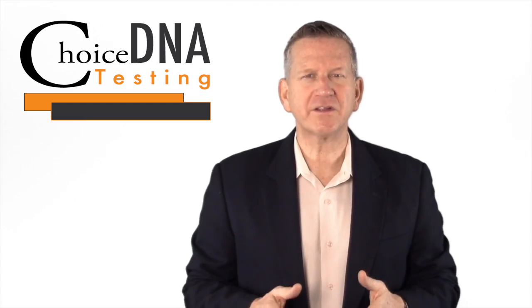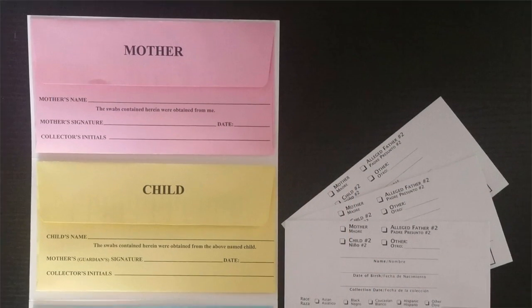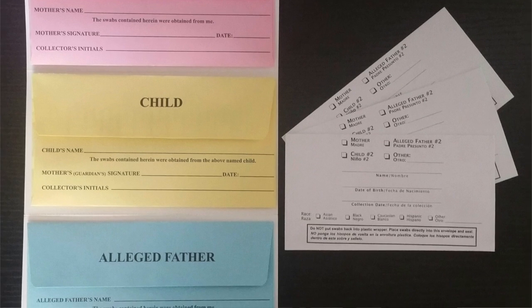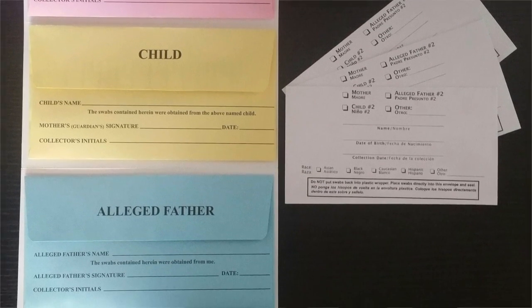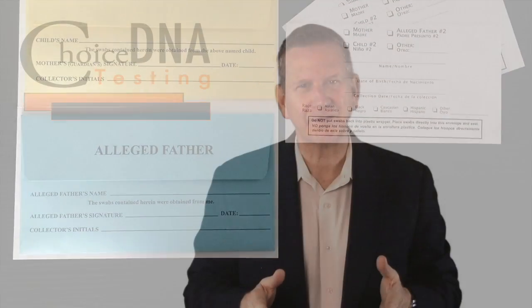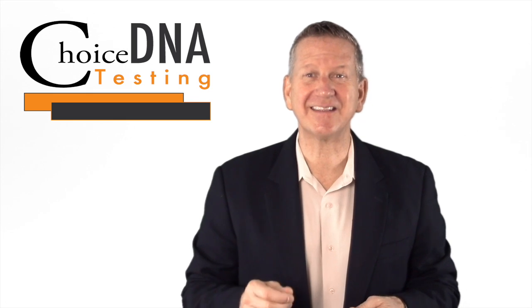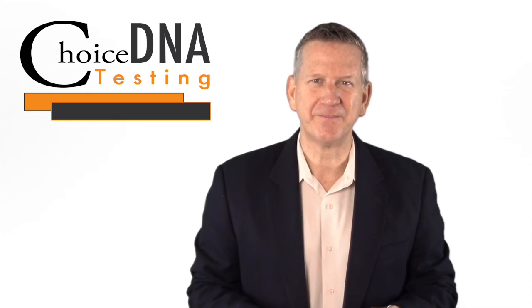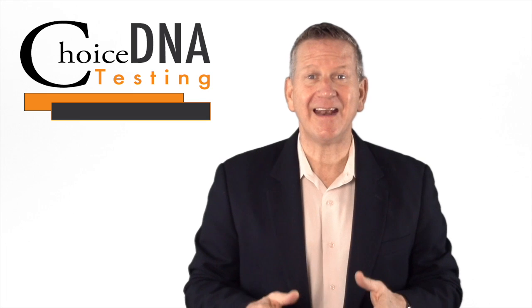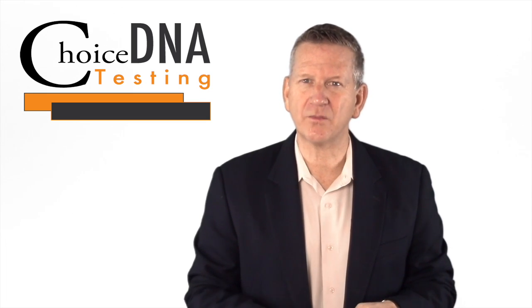Number three, remove the swab from the mouth and place it directly into the paper envelope labeled for that person. The swab will be wet and will get the envelope wet, but that's completely normal — it will dry within a few hours after the swab envelope is sealed. Contrary to some of your favorite television shows, the laboratory is testing the cheek cells in the swab, not the saliva. Repeat the swab collection process with the remaining swabs in that package for that person, using one swab on the right cheek and one on the left cheek. After both swabs have been used, discard the wrapper and seal the paper swab envelope labeled for that person.